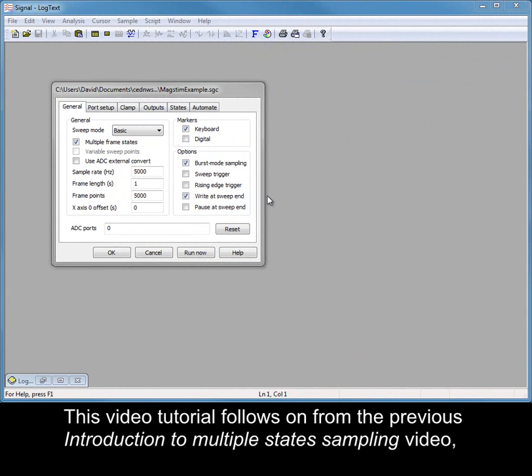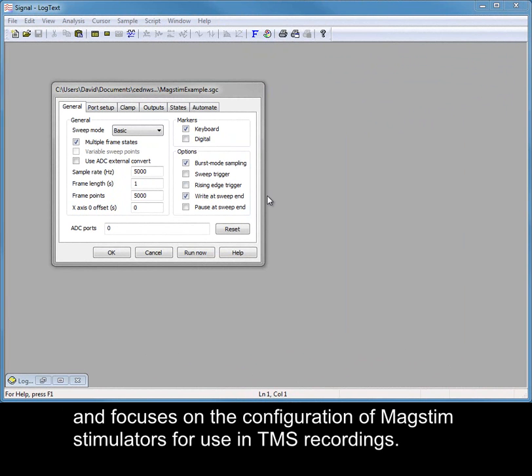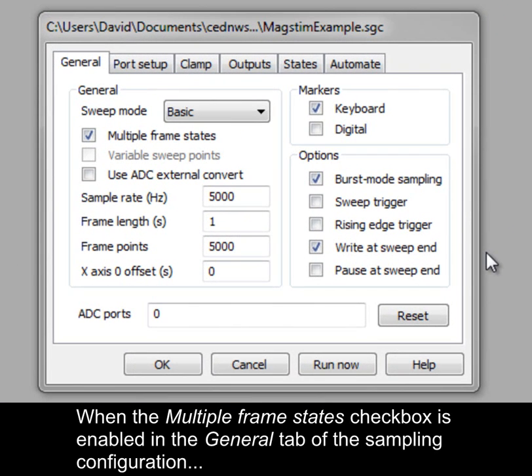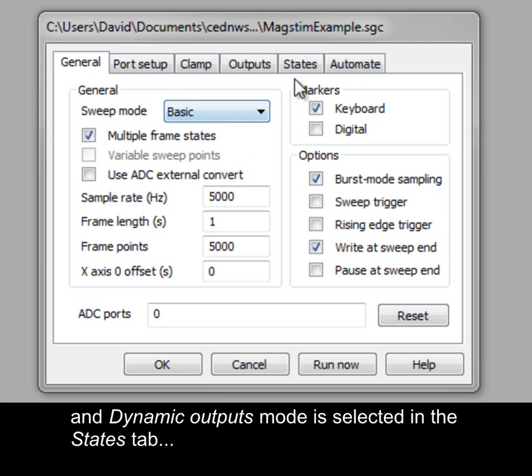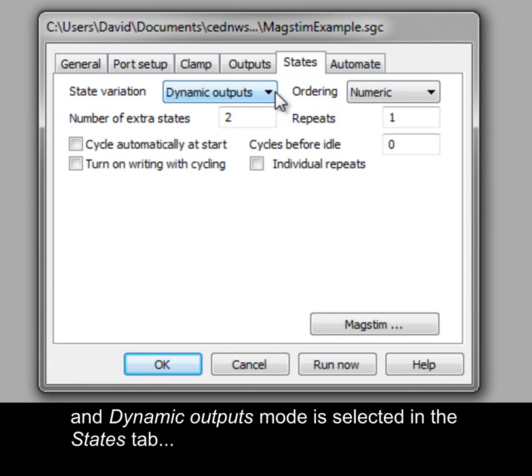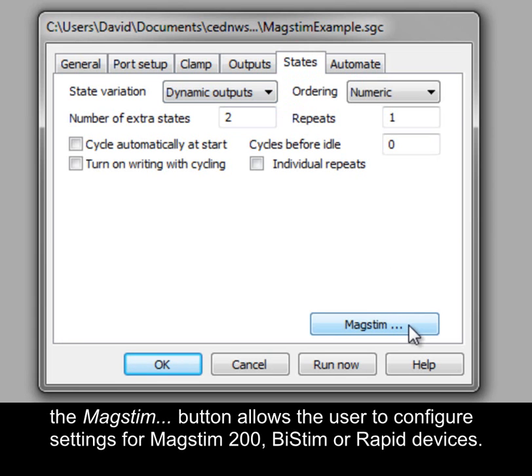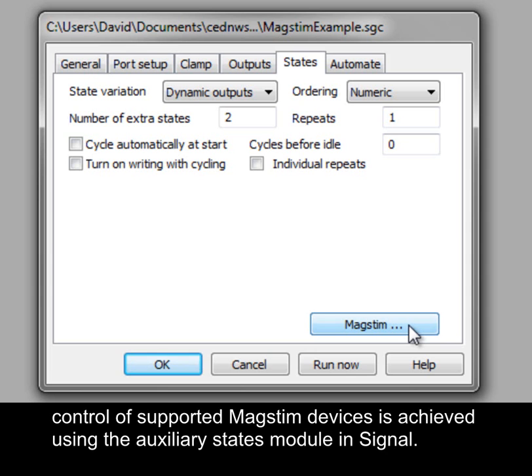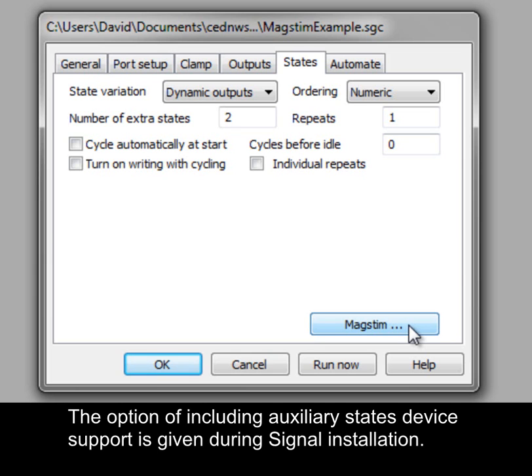This video tutorial follows on from the previous Introduction to Multiple States Sampling video, and focuses on the configuration of MagStim stimulators for use in TMS recordings. When the Multiple Frame States checkbox is enabled in the General tab of the sampling configuration and Dynamic Outputs mode is selected in the States tab, the MagStim button allows the user to configure settings for MagStim 200, BiStim or Rapid devices. Control of supported MagStim devices is achieved using the Auxiliary States module in Signal, the option for which is given during Signal installation.